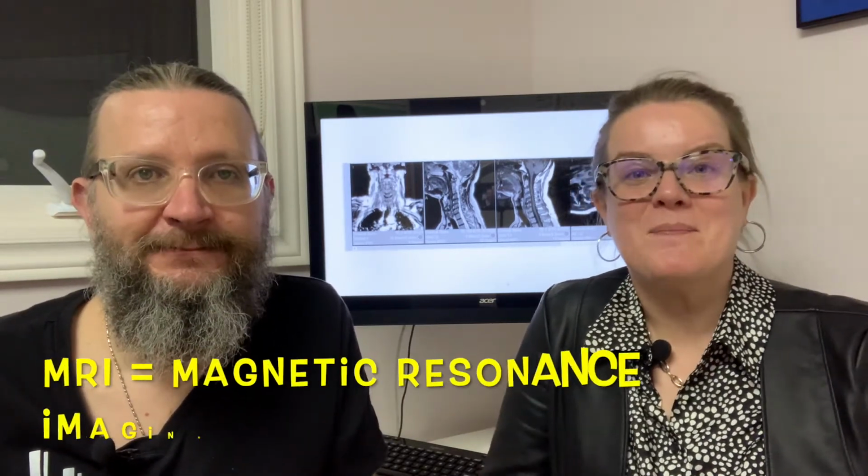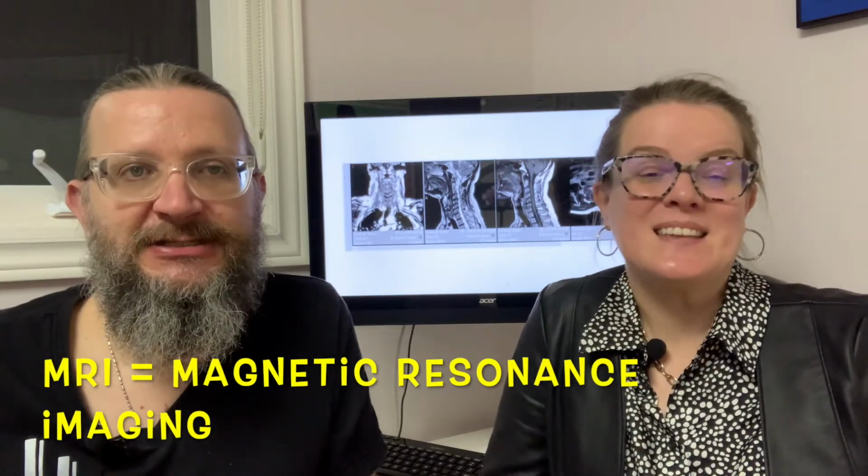So the third and final imaging modality that we're going to talk about is MRI, which is magnetic resonance imaging. A tongue twister, yeah. So with MRIs, what is great is you don't get the ionizing radiation that you would from an X-ray or a CT scan.